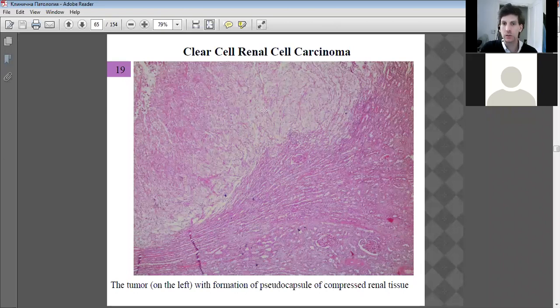Oh, that's good. Yeah. We looked at the renal last time, but yeah, we have the progression of carcinoma. And remember last time I said that the body attempts to isolate the cancer, the tumor, by developing lots of fibrous tissue, and you can see this mass of fibrous tissue here. The carcinoma is this mass on the upper left hand side, a lot of disruptive, abnormal cell division, if you like.